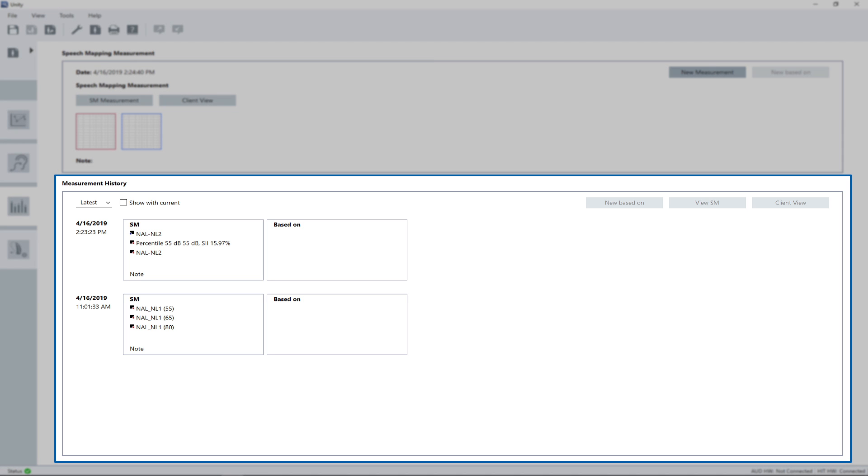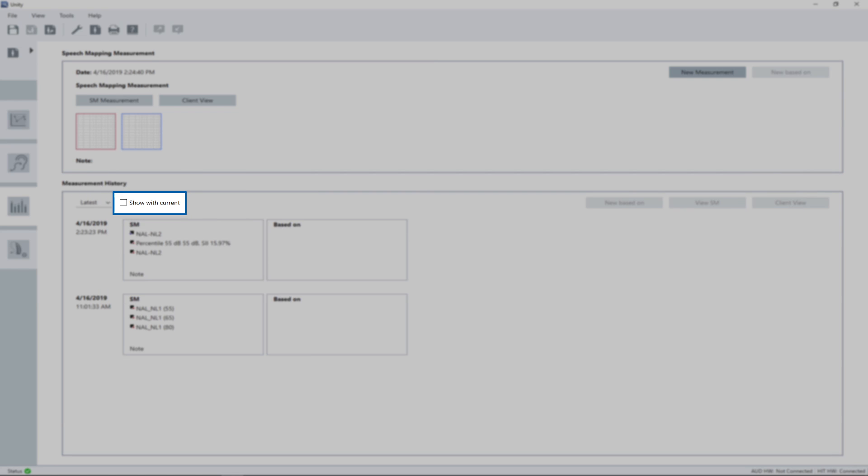On that main page you find a list of previous measurements in the area measurement history. Entries listed here can be double-clicked to open in read-only mode, or together with a new measurement if the box show with current is checked.